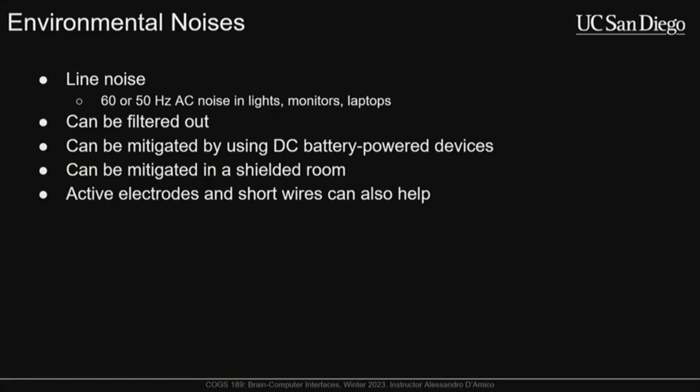We can mitigate the effects of the AC-powered lights by turning on a battery-powered light during data collection, or in some experiments, you just turn a light off. It really depends on the context. You want to be careful with using low light or no lights because it will make participants fall asleep. That happens a lot. They don't quite fall all the way asleep, but you can see them getting drowsy, and you have to correct for that.